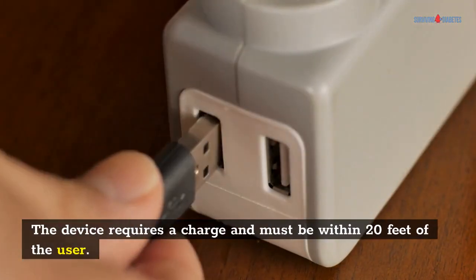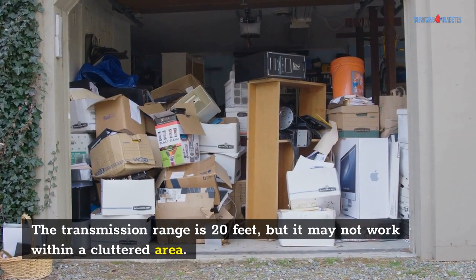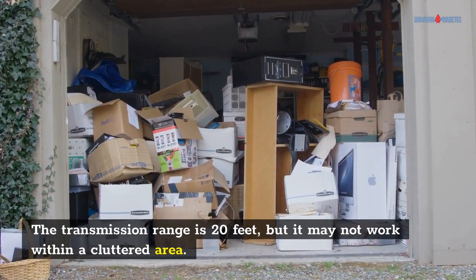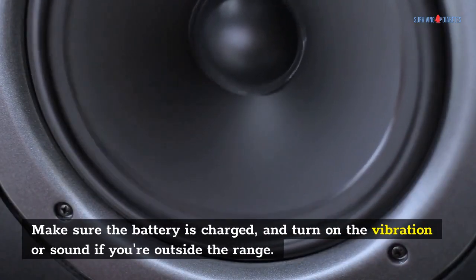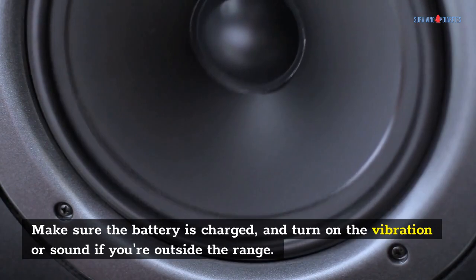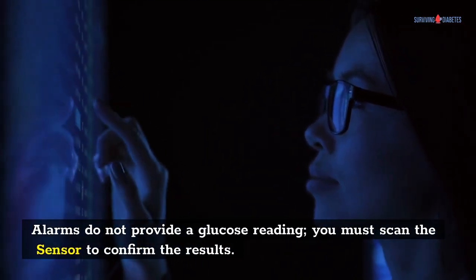The device requires a charge and must be within 20 feet of the user. The transmission range is 20 feet, but it may not work within a cluttered area. Make sure the battery is charged, and turn on the vibration or sound if you're outside the range. Alarms do not provide a glucose reading — you must scan the sensor to confirm the results.